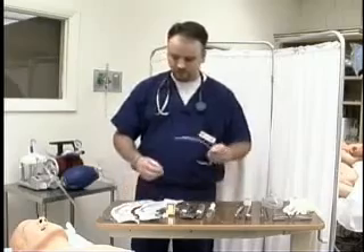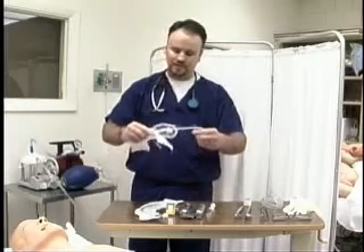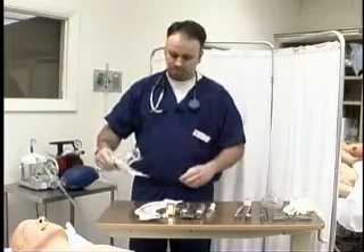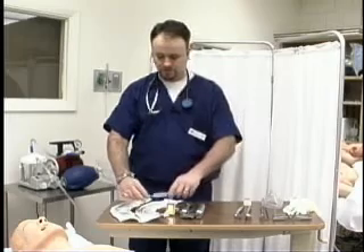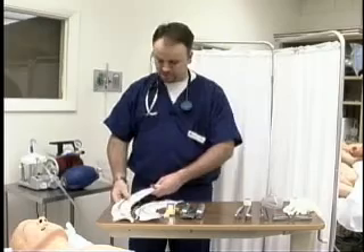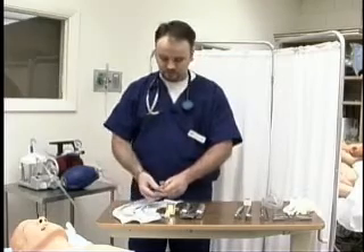We have to have a stylet as well. A stylet guides the endotracheal tube through the airway and also allows you to manipulate the tube. You slide it in like this, and then you can move your endotracheal tube and it'll stay in one place. We're also going to have a 10cc syringe to blow up the balloon once we're intubated, so we can inflate the cuff and secure the airway. It's good before you do the intubation to check your cuff while it's still in the package — press on it to make sure it's not leaking anywhere — and then deflate the cuff.